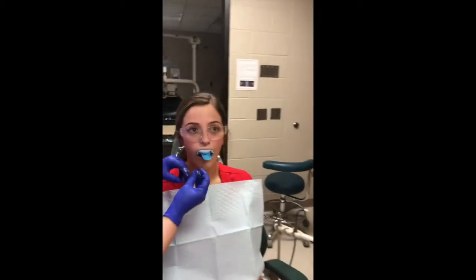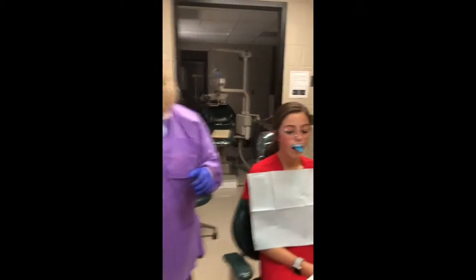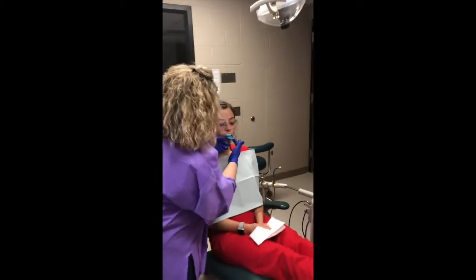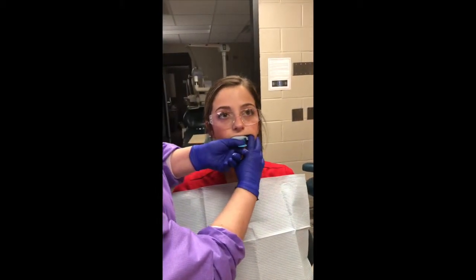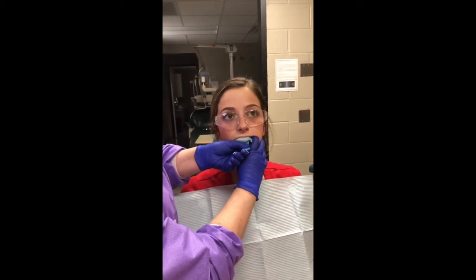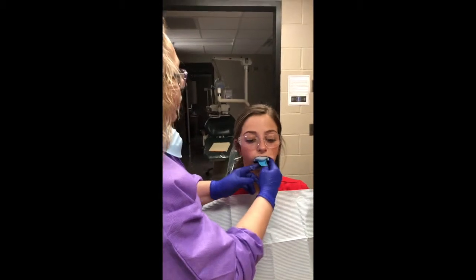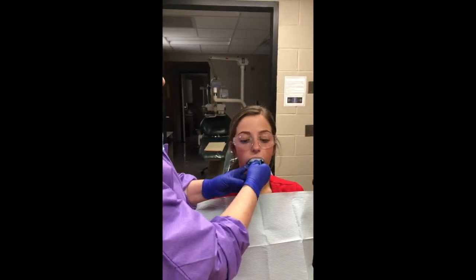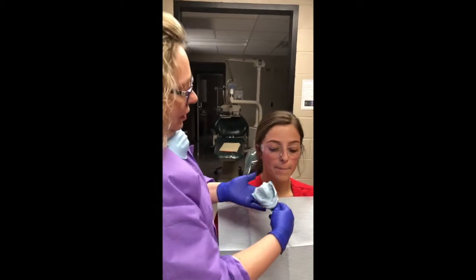Okay, so now it's starting to get nice and firmly set up. So the best way to remove it from our patient's mouth is to stick one finger sort of towards the side and kind of pull straight down to pop that seal a little bit, and then you can usually tilt it to kind of get it, and then pull it straight down and out.